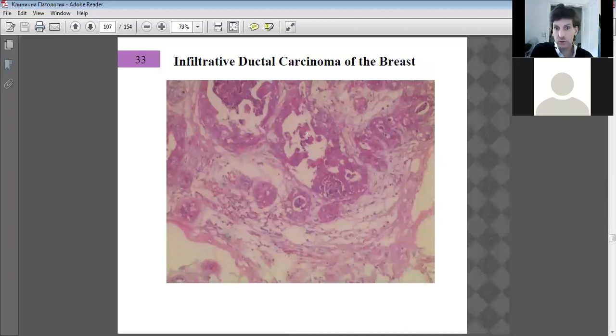Where you find necrosis, you tend to find darker areas and lots of little spaces, death of tissue, and then bigger spaces in the mass. And the disrupted cell division has caused a totally abnormal, generally abnormal tissue dynamic. Some remnants of hyaline fibers, so the hyaline fibers are being replaced by spaces as the tissue dies. This is the invasive tumor, growing all around you.